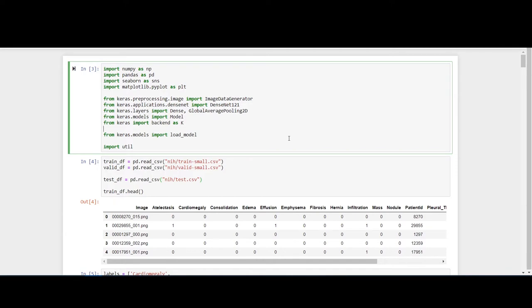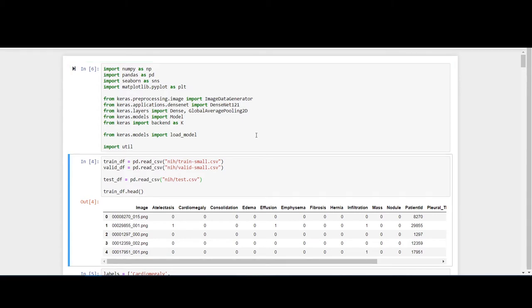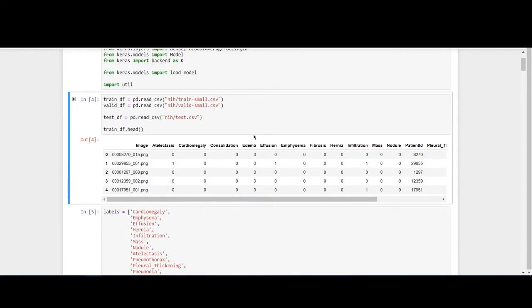We are here to present our MLOps project, which is chest X-ray medical diagnosis with deep learning. This video is a presentation on our project and even a tutorial of our project. So let's start. As you can see, these are the libraries we'll be importing for creating our model. The cells have successfully run, perfect. And then we are loading the dataset in this cell.